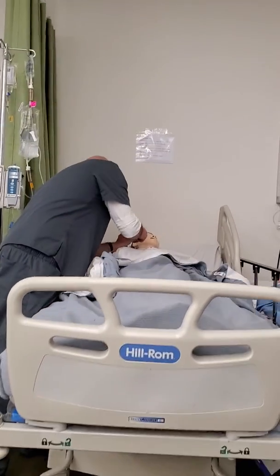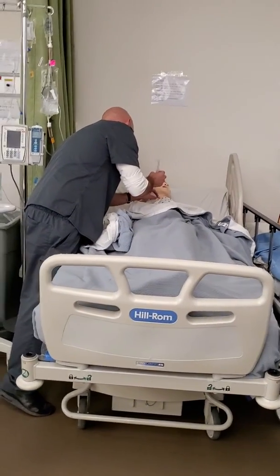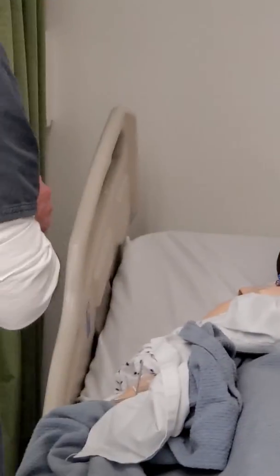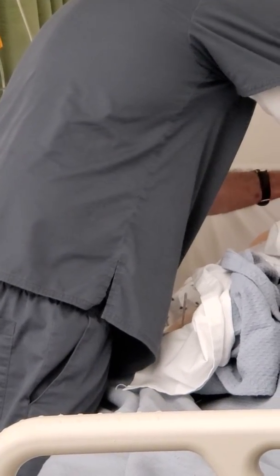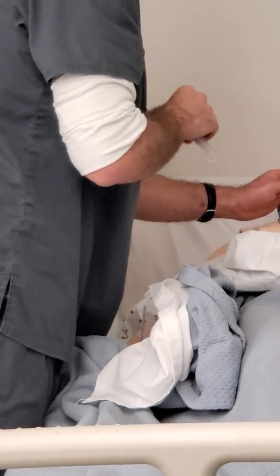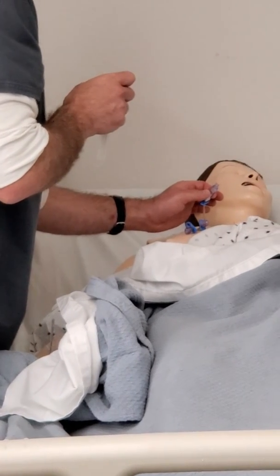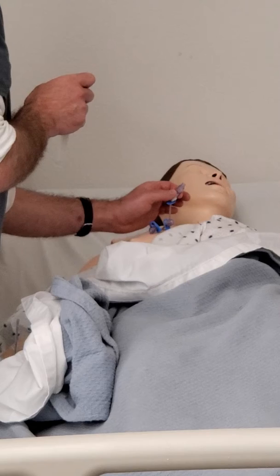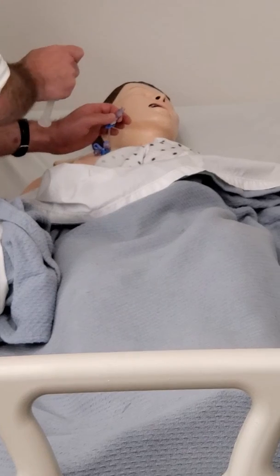How are you doing, Miss Tripp? I'm alright. You're okay? Alright, I'm gonna flush your line. So I'm gonna do my clean. I don't need gloves. So I'm gonna clean that. For how long? 15 seconds and then wait for it to be dry. So when you're practicing, don't shortcut, don't shortchange yourself, because you're gonna find yourself in the clinical setting going 15, done. Okay. Right, so really practice using 15 seconds. So I will clean that for 15 seconds.